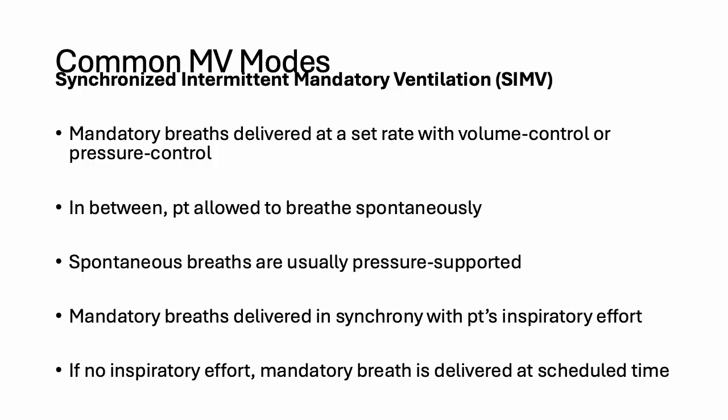Then, somewhere in between, we have the so-called SIMV. That stands for Synchronized Intermittent Mandatory Ventilation, SIMV. Intermittent, which means there is a mixture of mandatory breaths and spontaneous breaths. In this case, machine breaths are set, whether it's volume controlled or pressure controlled.